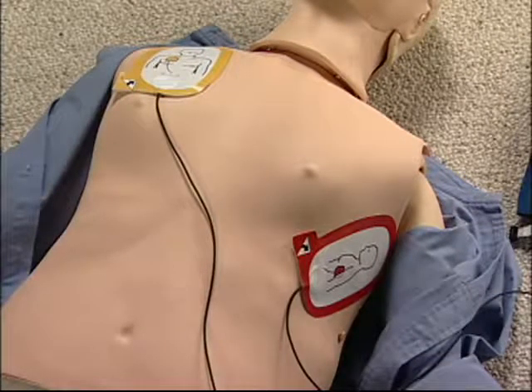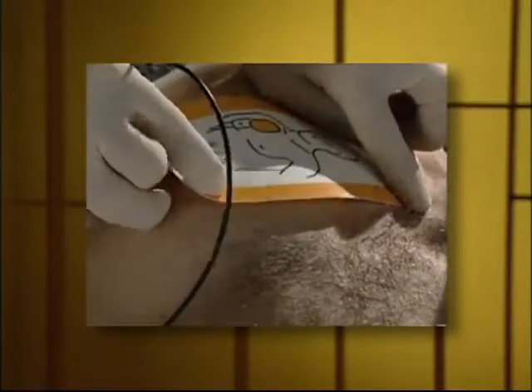The important thing is that you put them on the patient right where their pictures show, and stick them down firmly. Now, if there's a lot of hair on the patient's chest, you can use a razor to quickly shave their chest where the pad will go. Some versions of the Lifepak AED come with a kit that includes a razor. If it's just a little hair, go ahead and stick the pads on over the hair. The important thing is that the whole pad makes good contact with the skin.